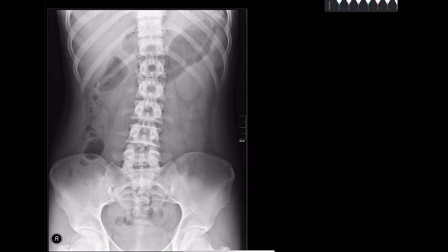One very important point: the GI tract contains gas. When lying supine, fluid will displace posteriorly and gas will rise up anteriorly to lie above it. That is why an anterior-posterior supine x-ray will not demonstrate air-fluid levels. We need a lateral decubitus view if the patient cannot stand, or we need an erect posture to see air-fluid levels.